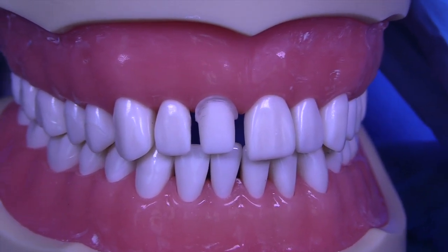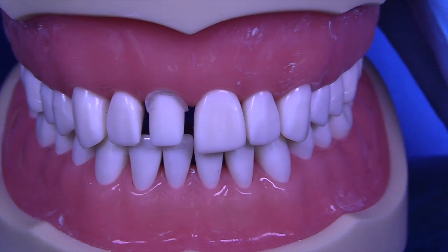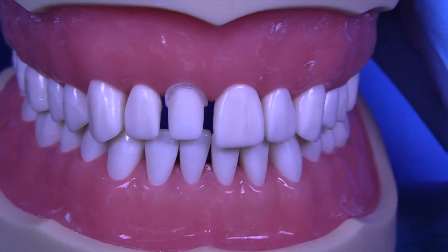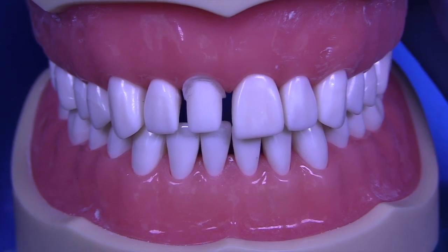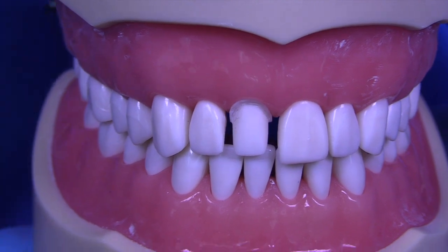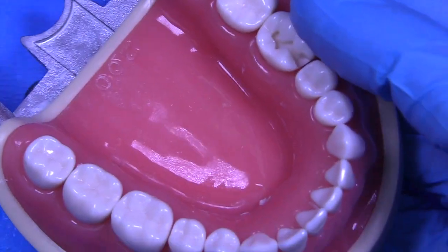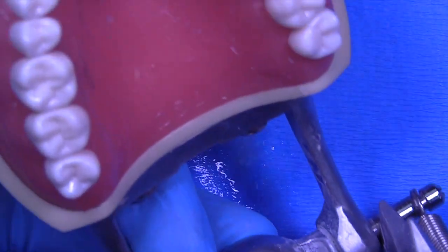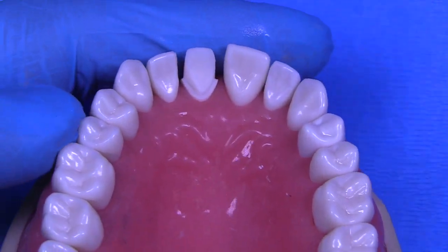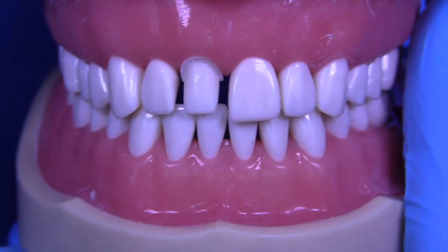In fact, it looks a lot like an all-ceramic preparation where the parameters can sometimes be a little bit less reduction because we're making the material all out of one dental restorative material rather than multiple materials. So I hope that that makes sense. I think you passed them both, but I'd like to see you work a little bit more on some of the details we mentioned, and that is that.